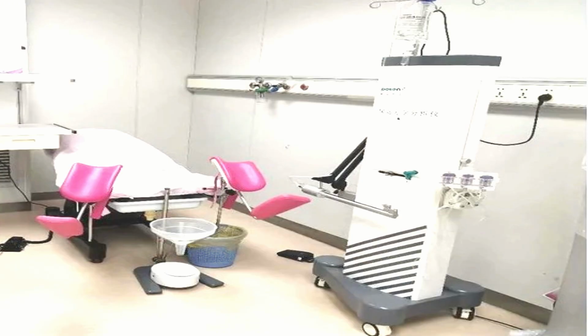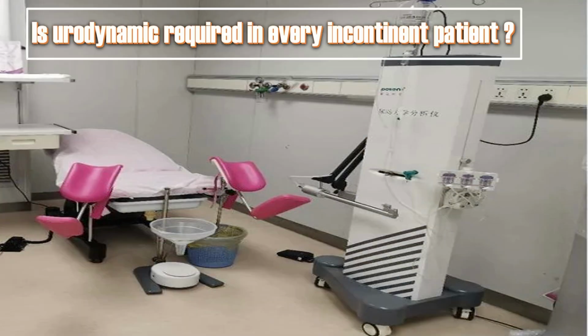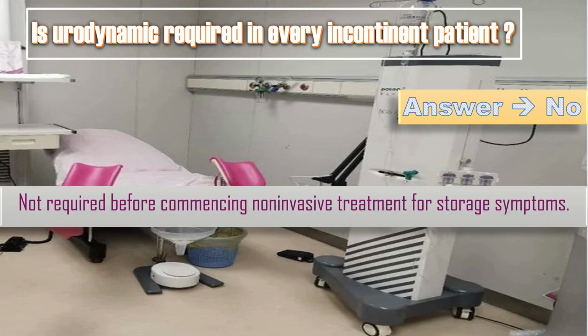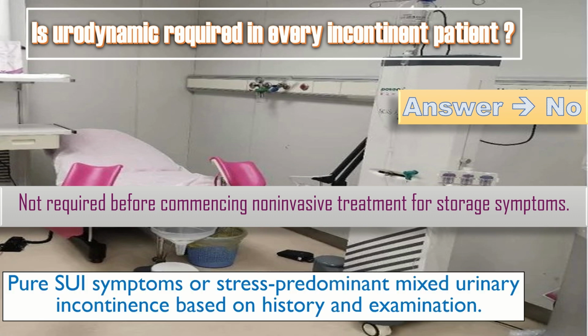Is urodynamics required in every incontinent patient? The answer is no. Urodynamics is not required before commencing non-invasive treatment for storage symptoms. It is not recommended before surgery in women who report only pure stress urinary incontinence symptoms or stress predominant mixed urinary incontinence based on history and examination.